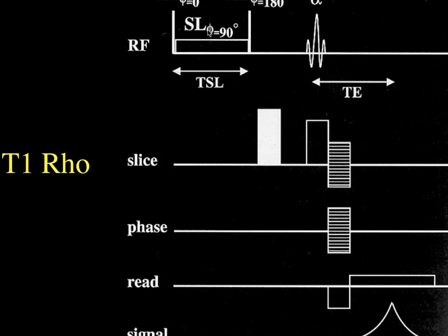It turns out when you do this that roughly what you're actually calculating here is what the T1 would be if the Larmor frequency were zero. That is, it's what the T1 would be if you're measuring it when there's no magnetic field. But we can't measure it at no magnetic field because you can't get an echo. So this is a way to trick the spins into allowing us to measure what the T1 would be if we were actually measuring it at zero magnetic field.